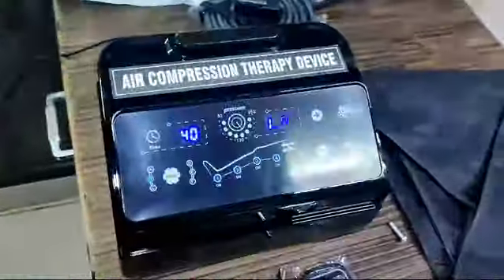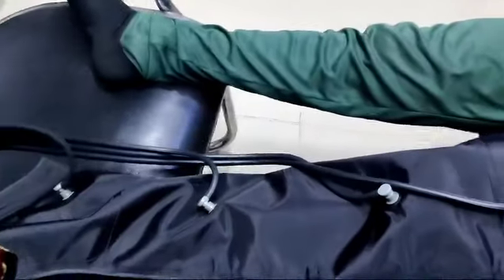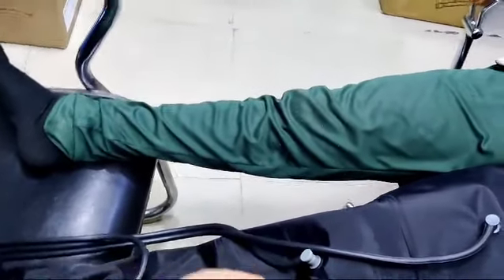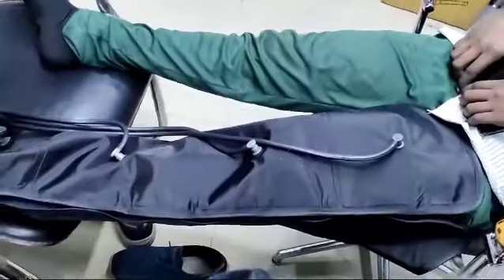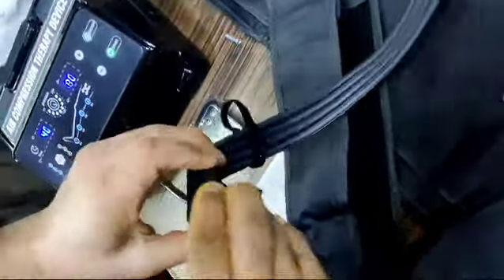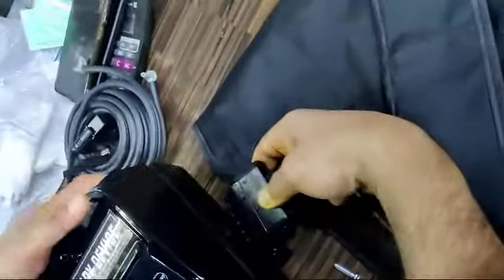Next, get the tube. I have connected it to the leg of the patient. These are leg attachments — one, two, three, four chambers. I am now connecting the tube: one, two, three, four. The tube is connected and the attachment is worn by the patient. Now open the cap and place it over here.